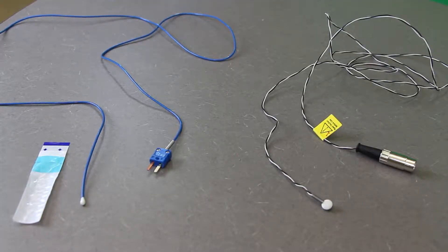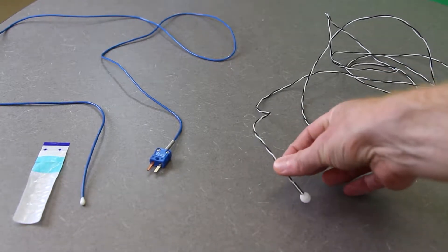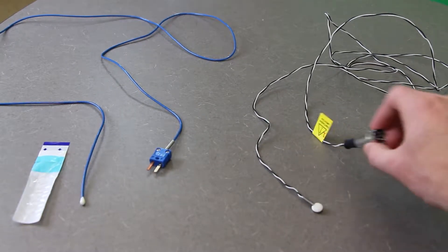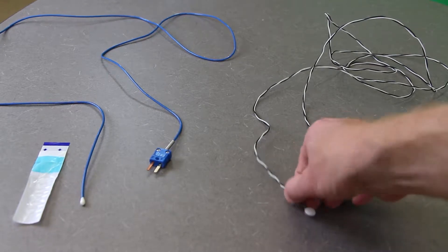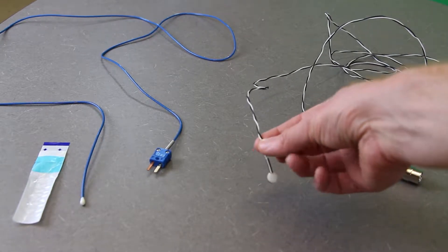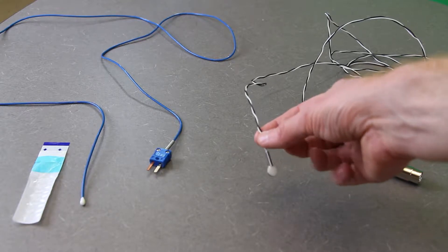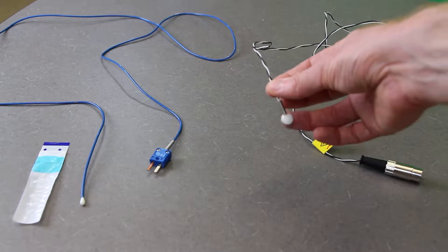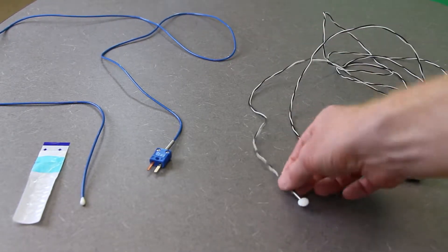What we have here is the skin temperature probe, which is this little ceramic end with the silver metal backing, and you can see that it has a DIN connector. What you would essentially do is just tape this onto the skin wherever you wanted to get the measurement and make sure that the ceramic or the metal is in direct contact with the skin — no air space between them in any way.